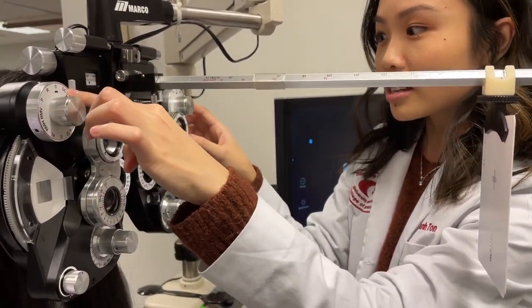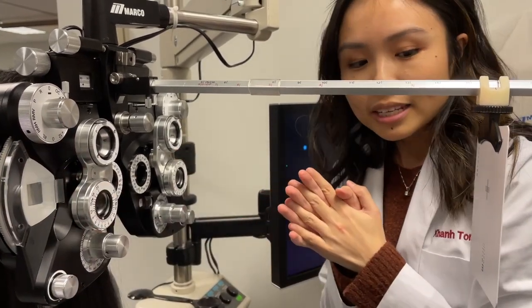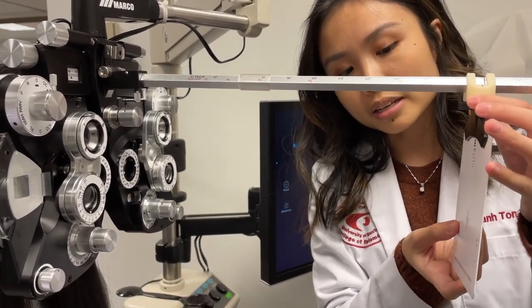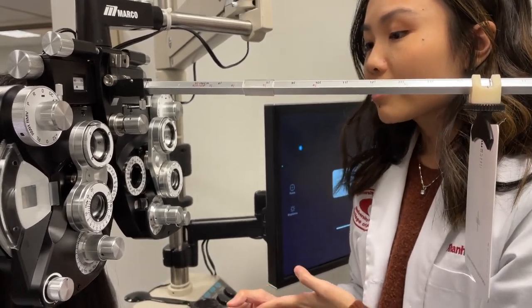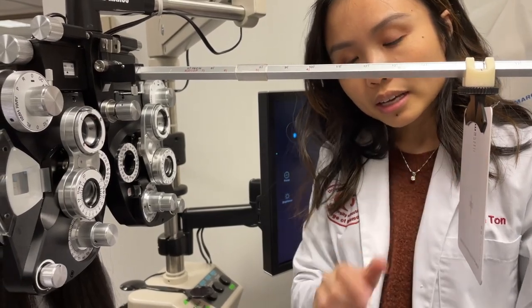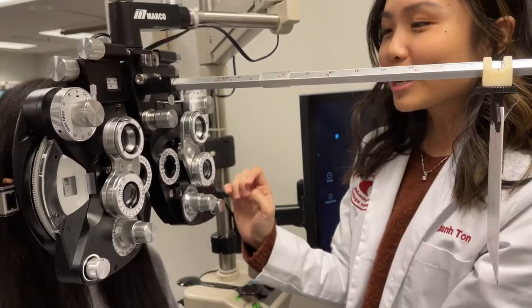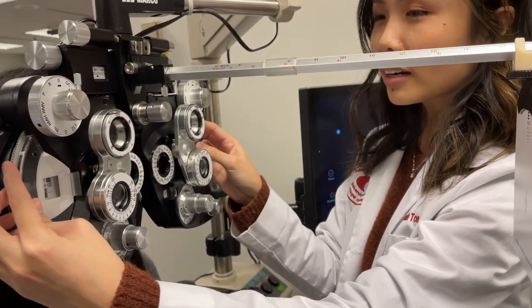Then we're going to take out the aux lens, and then I'm going to go back to my original base. All right, Mrs. Lee, I'm now going to be checking to see how well your eyes are focusing up close again. And then I will be starting from the base of your distance prescription. Go ahead and look at that last line right there. Can you read it to me? T-P-E-O-L-F-D-Z. All right, Mrs. Lee, I'm going to change these lenses. You let me know when it's so blurry that you can't make it out anymore, okay? Mm-hmm.